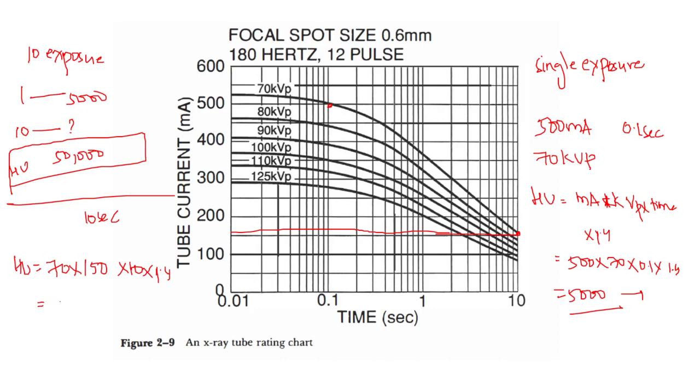This will result in 1,56,000 heat units obtained. Here the input is almost 50,000. 50,000 is obviously less when compared to 1,56,000. So obviously we can use this method.